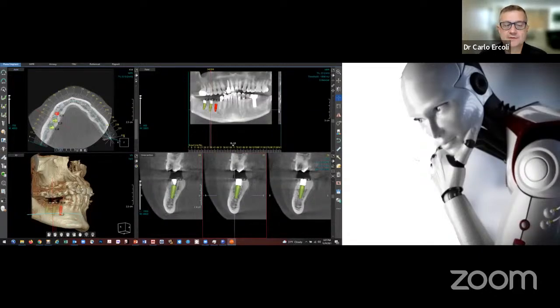This is a CT scan, and you can see that two implants in the areas of, if you use the international system, 46 and 47, had actually been placed already. However, there was no thought process about the interocclusal space. The interocclusal space available in this specific case is about 2 millimeter, 3 millimeter at the most. So again, you do not have the space for the restoration.